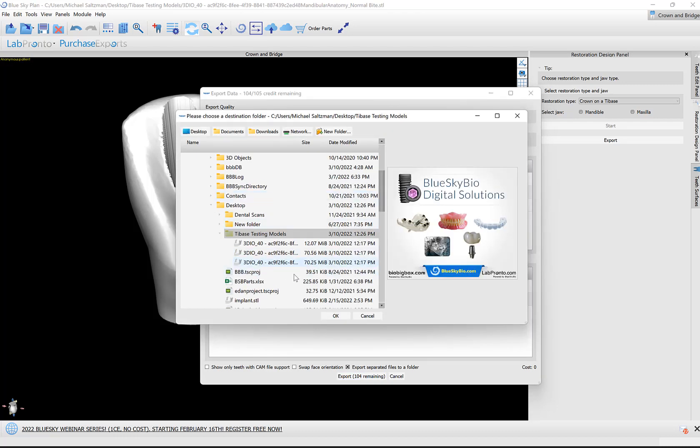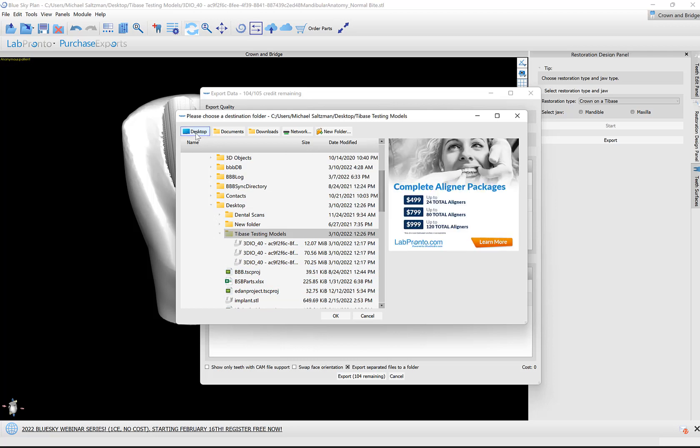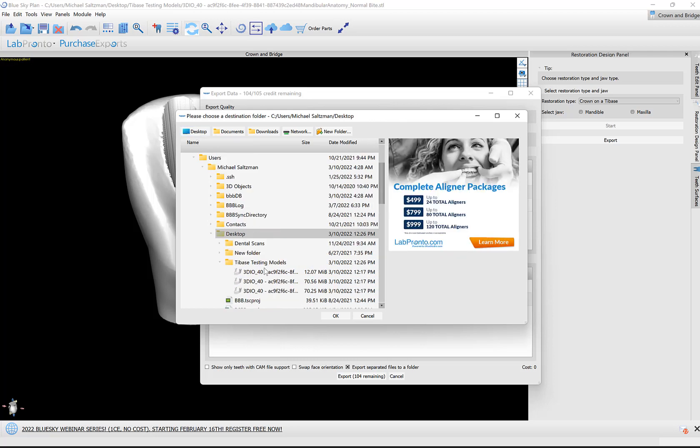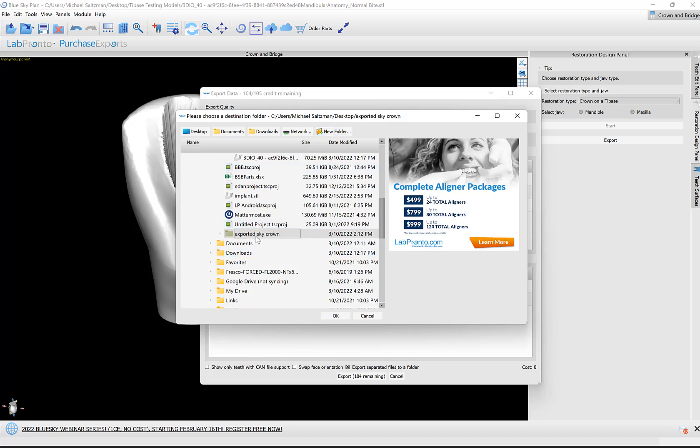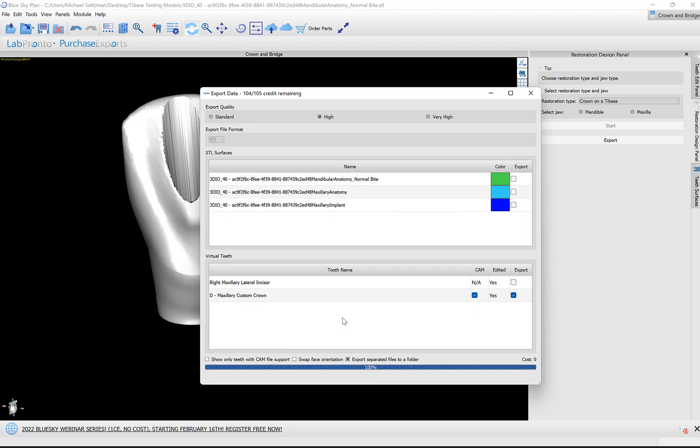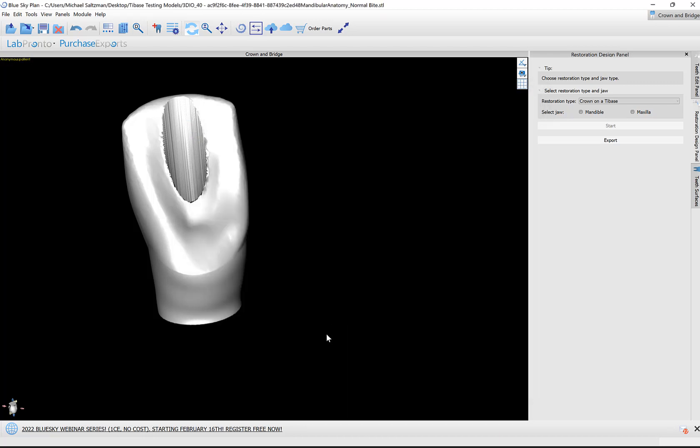The software asks us for a location where we would like to save that. I'm going to make a folder on my desktop: New Folder, 'Exported Sky Crown,' and click OK. The folder is selected. Click OK. Exports complete.